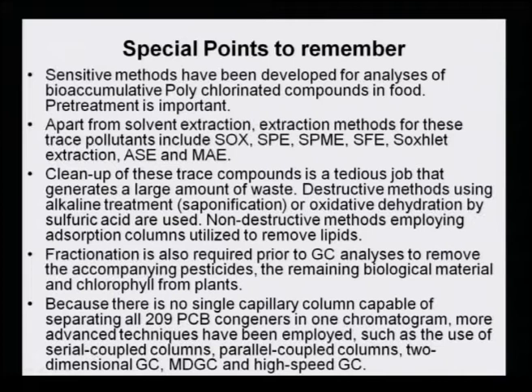The special points that need to be remembered in this lecture are the following. Sensitive methods have been developed for analysis of bioaccumulated polychlorinated compounds in food. Pre-treatment is important. Apart from solvent extraction, extraction methods for these trace pollutants include the Soxhlet, solid phase extraction, solid phase microextraction, supercritical fluid extraction, accelerated solvent extraction, and microwave accelerated extraction.